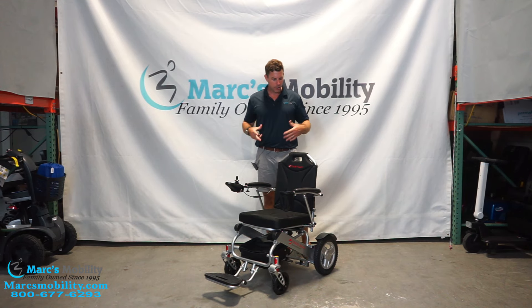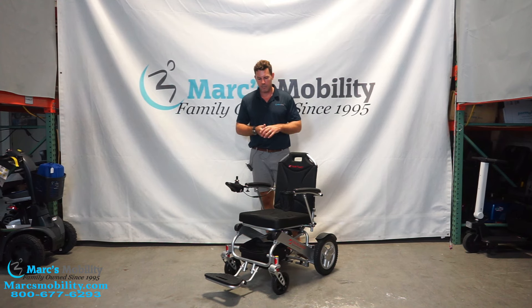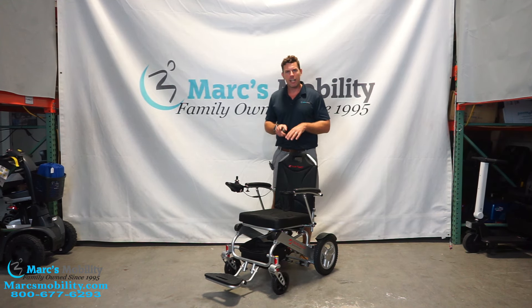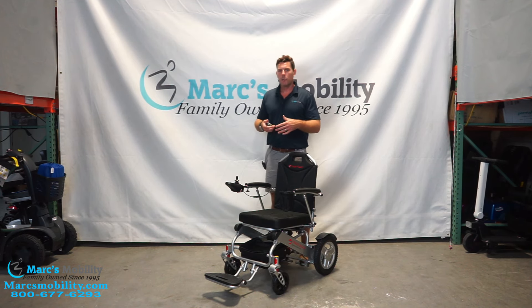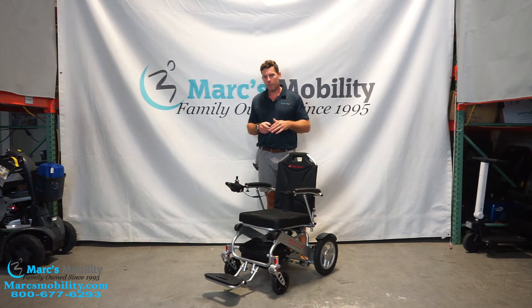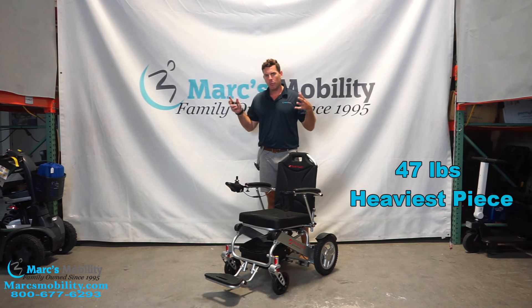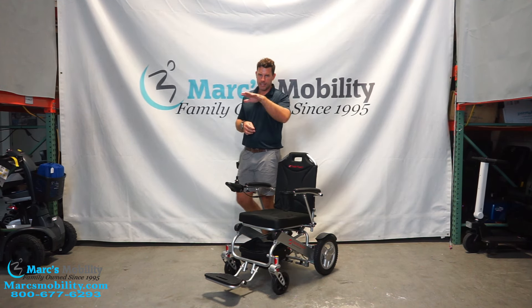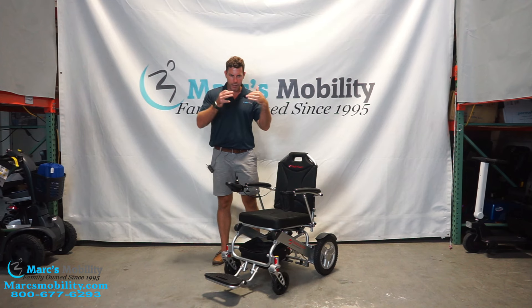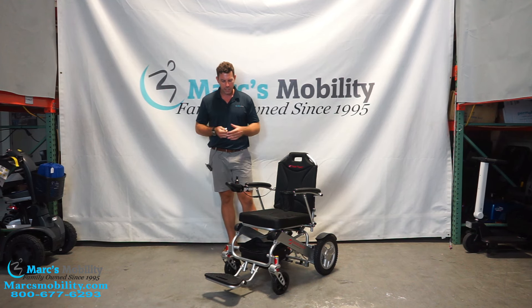Later in the video I'll show you how this folds up and how you can take the rear wheels off. It is 75 pounds with the unit fully assembled, batteries in and wheels on. When you take the rear wheels off, you can drop it down to 47 pounds — that's the lightest you can get it. I have seen 65 and 40 listed online, but it is 75 fully assembled and 47 with the rear wheels removed.